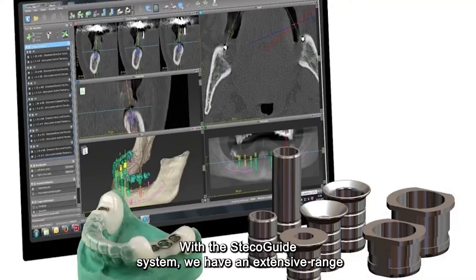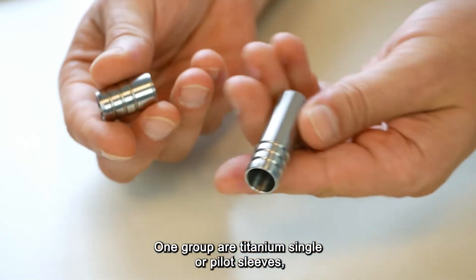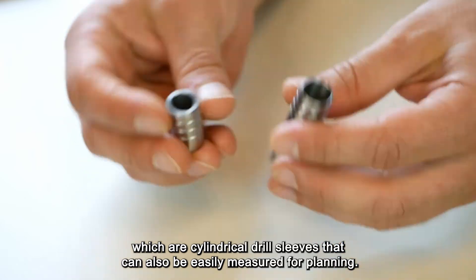With the Steca guide system we have an extensive range of different drill sleeves for implant planning and guided surgery. One group are titanium single or pilot sleeves, which are cylindrical drill sleeves that can also be easily measured for planning.